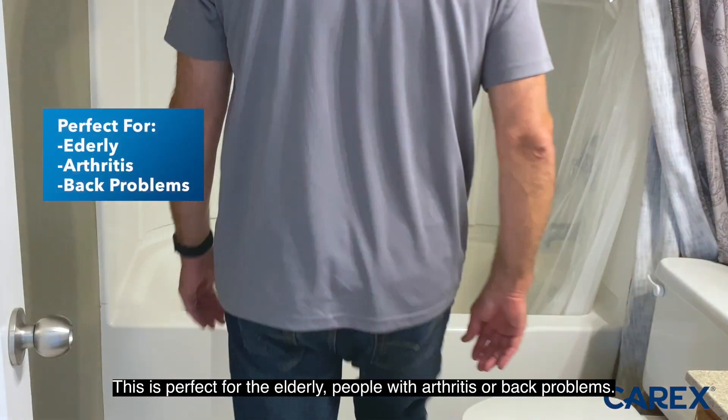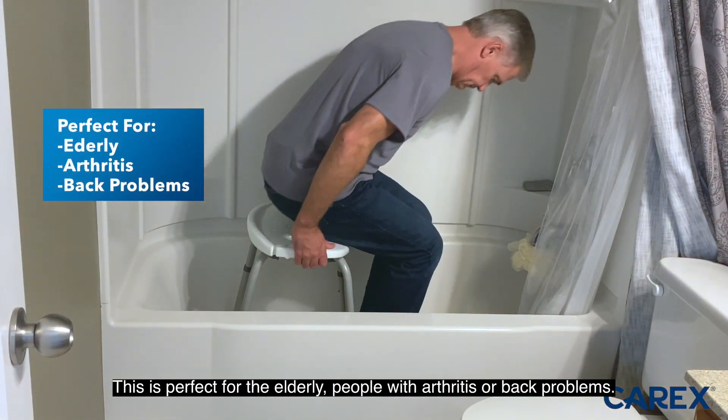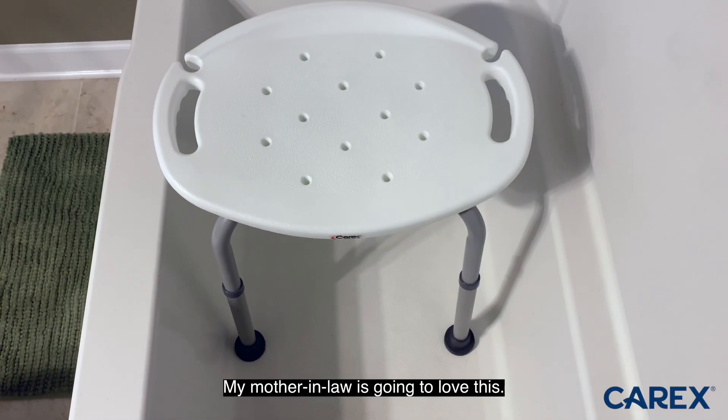This is perfect for the elderly, people with arthritis or back problems. My mother-in-law is going to love this.